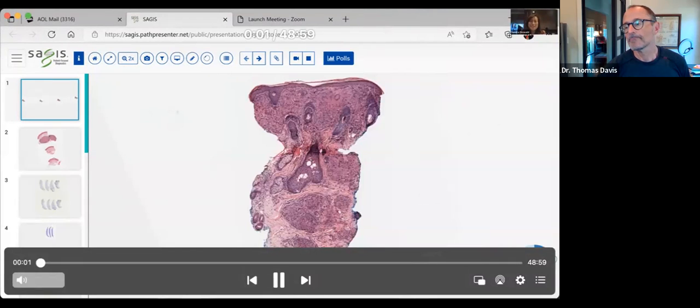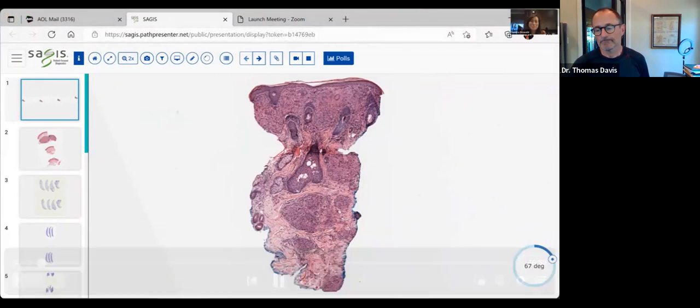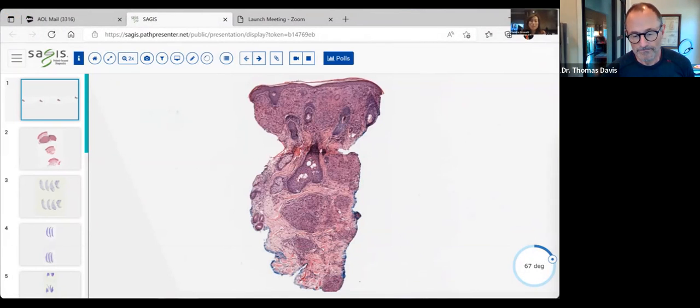I'm Dr. Osswald, and welcome. Thank you so much for attending the next Sagis topic discussion. I'm happy to be here again. Today, we're going to talk about big cells. So I entitled this, Bigger is Not Always Better. And the reason why I did is because the residents are always asking about these big cells, and I thought I'd have a collection of entities with big cells. So thank you so much, Dr. Davis, for helping me to pull these slides for today's session.